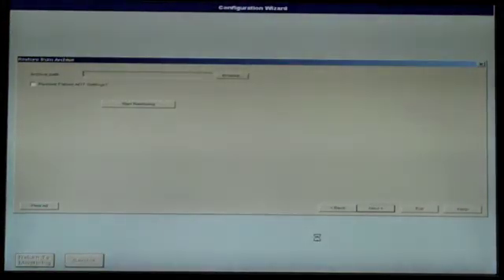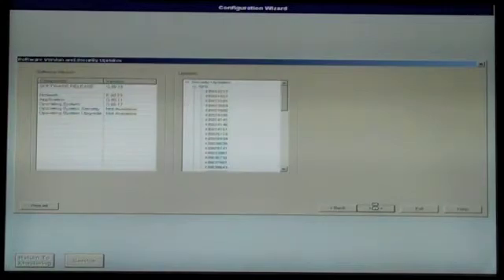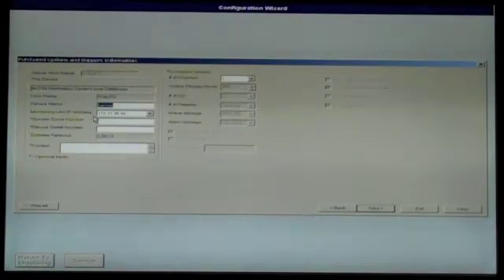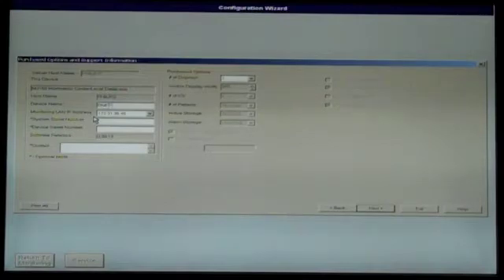Skip through the Restore from Archive and Software Version and Security Updates by clicking Next. At the Purchase Options and Support Information screen, you can rename the Central in the Device Name box. Once this is done or you do not wish to change it, click Next.